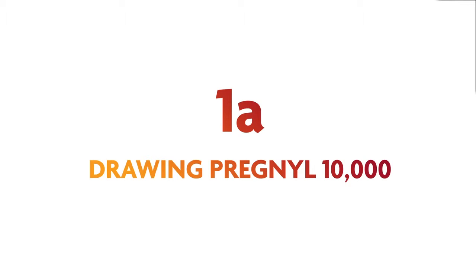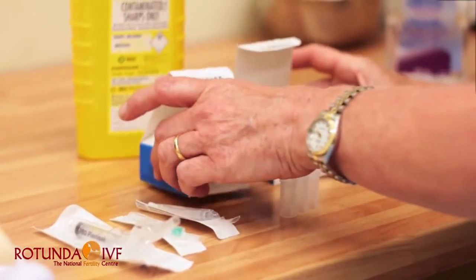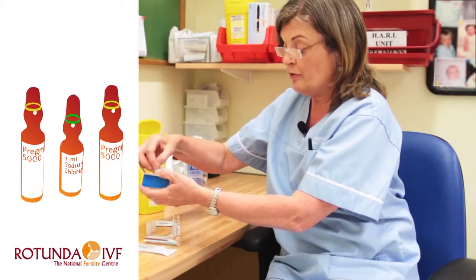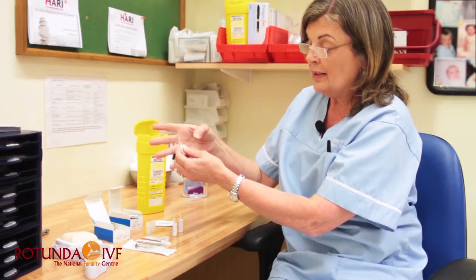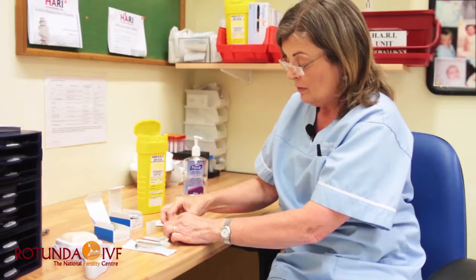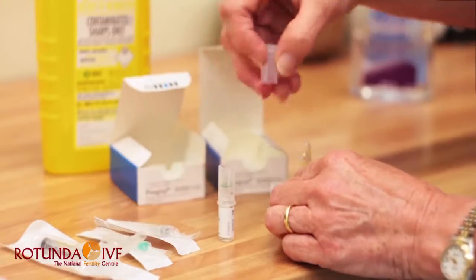I will now demonstrate Pregnyl 10,000 and how to draw it up. This time you've got 2 boxes. Take the powder and water out of 1 box. And out of the second box, we just need the powder. Just check that you've got the larger ampoule, that's the powder. Take the 1 vial of water and again just flick the top of it to get the fluid down beneath the neck. Take your 3 ampoule covers and pop them on the top of these ampoules.